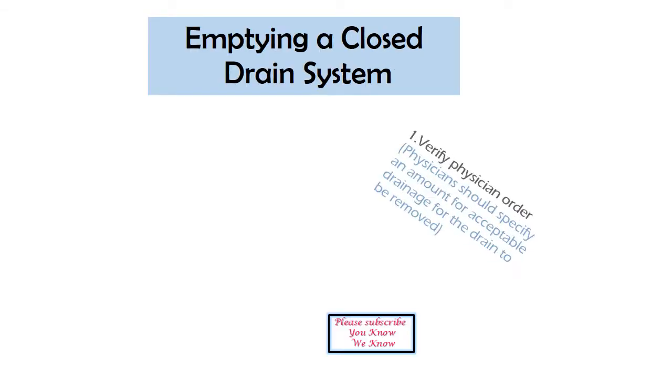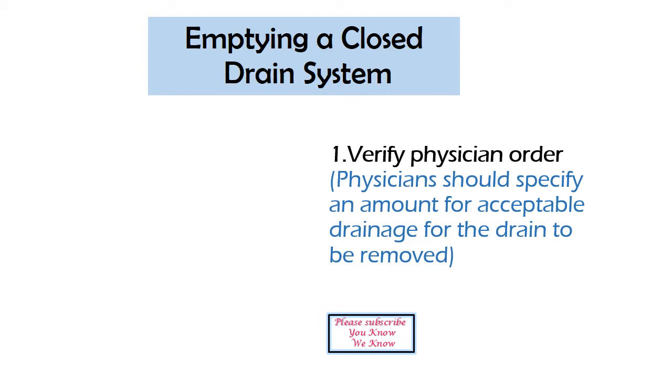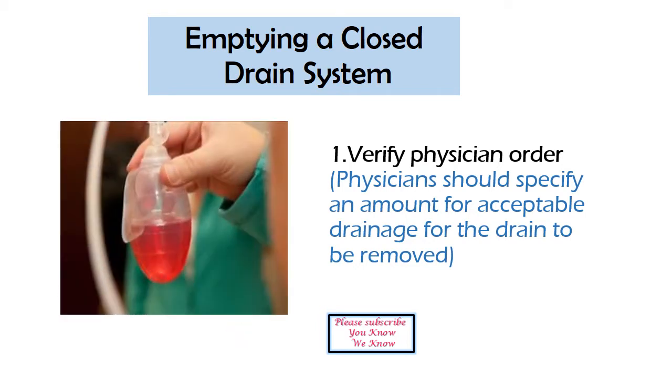Emptying a closed drain system. Verify the physician order. The physician should specify an amount of acceptable drainage for the drain to be removed.